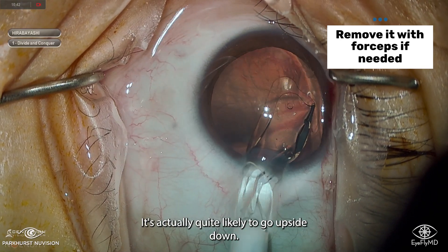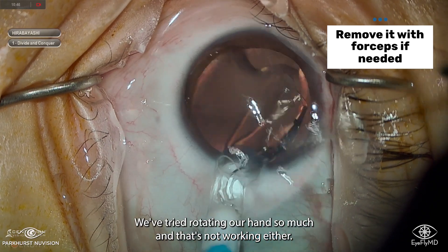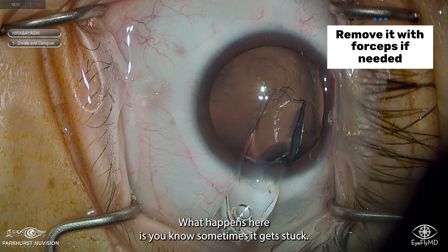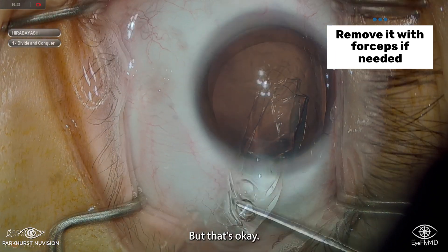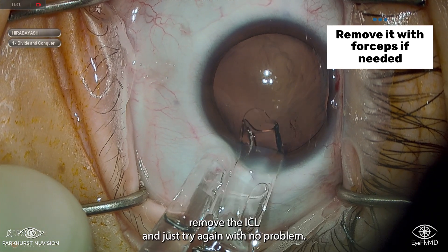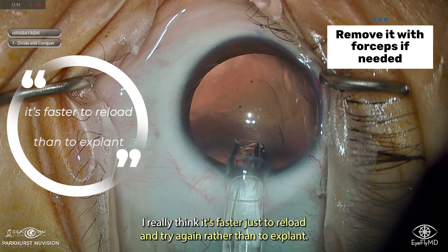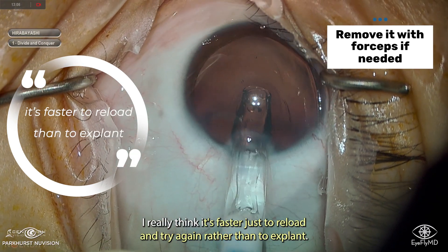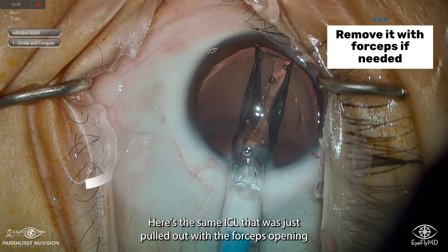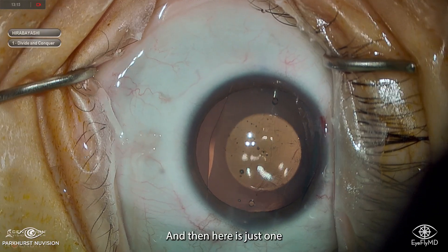Here you can see the leading haptics — that's not going to work, it's likely to go upside down. We've tried rotating the injector and that's not working either, so we're going to give up. Sometimes it gets stuck, but that's okay — we'll use a pair of gentle forceps to remove the ICL and try again. I really think it's faster to reload and try again rather than to explant. Here's the same ICL that was just pulled out with the forceps, opening no problem.